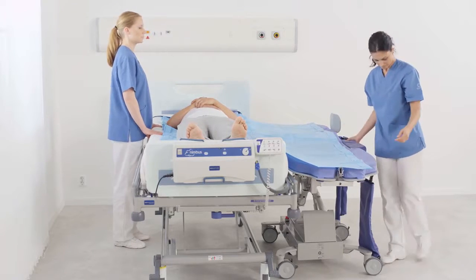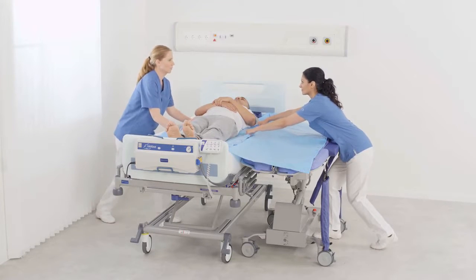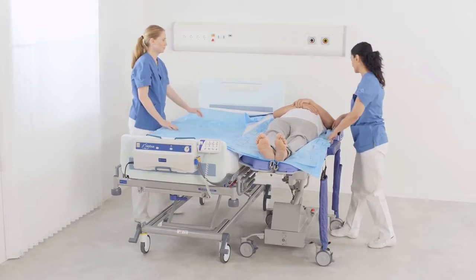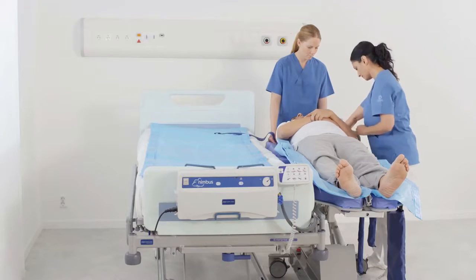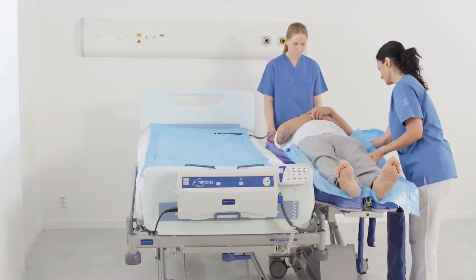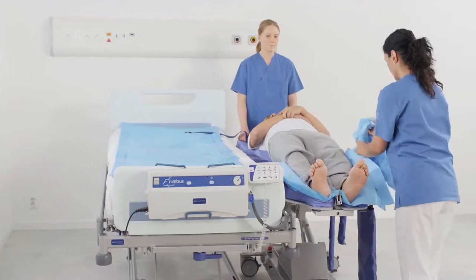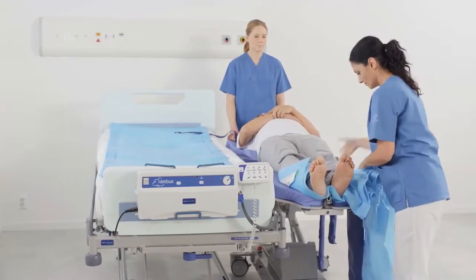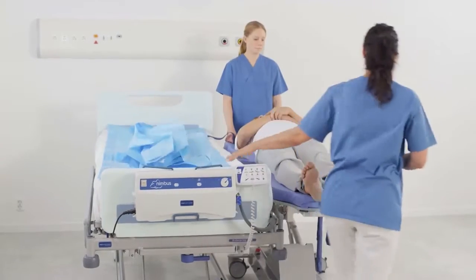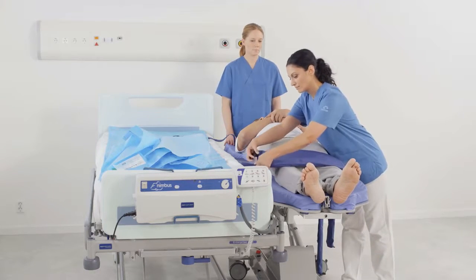Check that the brakes are applied. Caregiver 1 gently pulls the handles on the sliding aid to transfer the patient. Caregiver 2 stabilizes and gently pushes the patient over to Sara Combilizer. Gently roll the sliding aid out from underneath the patient at a 45-degree angle. Place the safety straps over the patient's body.